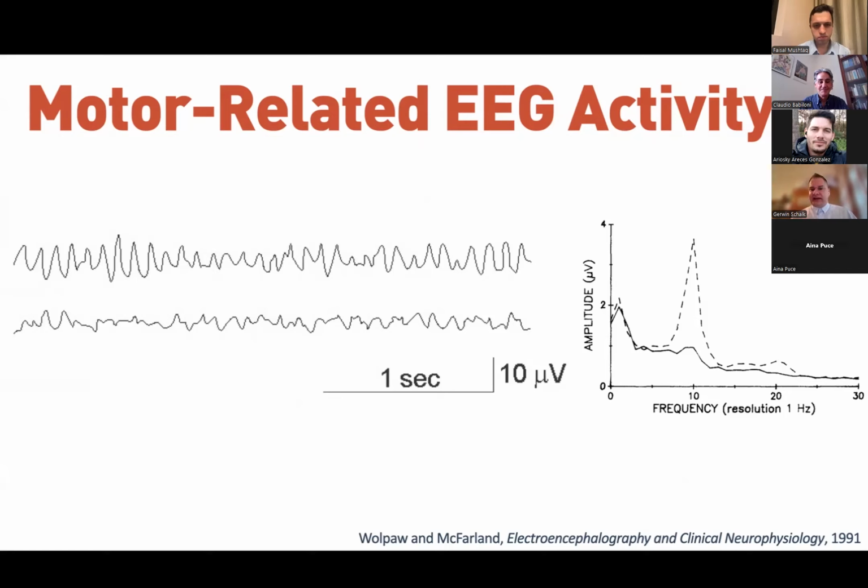And what we have seen, in particular in more recent years, is layering methods upon methods. So, for example, in electrocorticography, which I'll talk about in just a moment, it's become very popular to do things like phase amplitude coupling. So it's the relationship between two different frequencies. Of course, we can have relationships between two different locations and things like that.